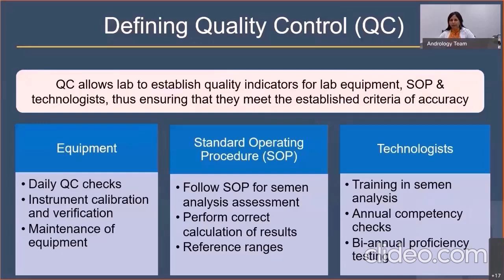And then there is external quality control, which is the proficiency testing, and the proficiency materials are sent by certain accreditation bodies. In the United States, we have the College of American Pathologists, from whom we receive these analytes twice a year, and these are tested by the technologists to assure that the testing process within the laboratory is being conducted correctly.